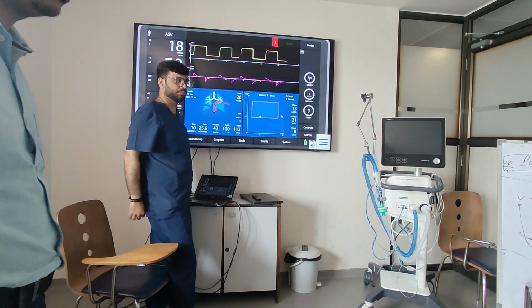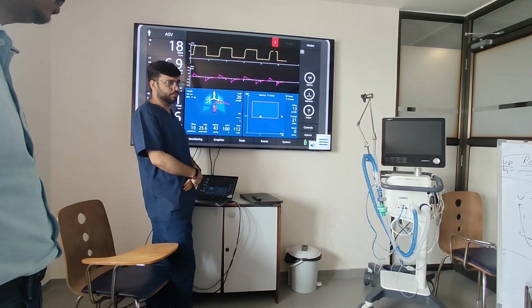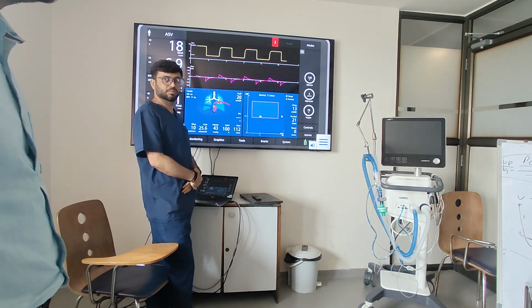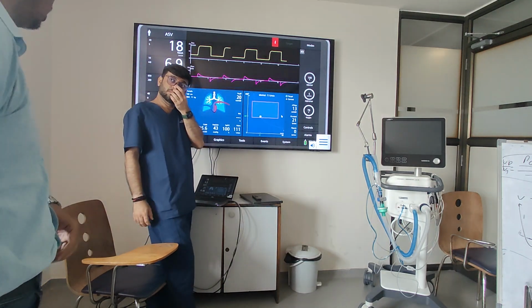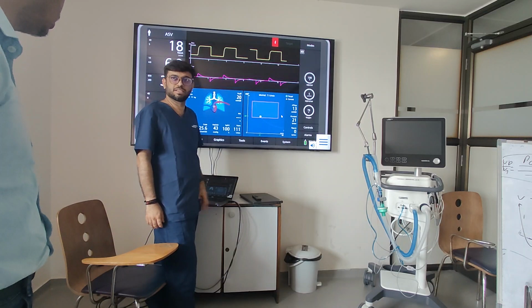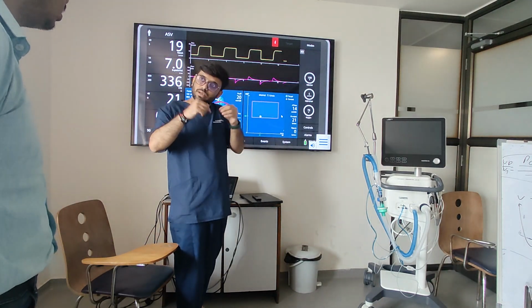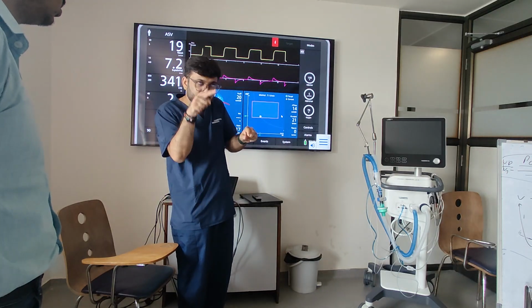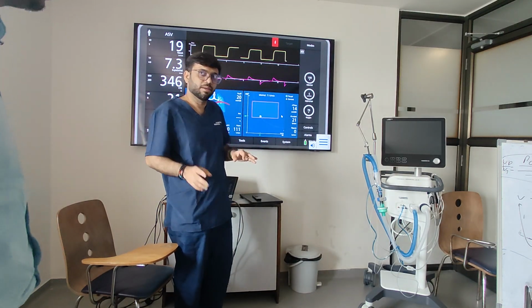to the lung. This has not caused injury to the lung, but at the same time, it is telling you to do something. There is something wrong. You understand? It has not caused injury to the lung. It has given you time, and you have to decide what is to be done. So this has just achieved the target. Yes, just achieved the target. But even if it remains inside, it is still safe. Sometimes it will rotate inside the box but might not reach the target, but you still don't have to worry.